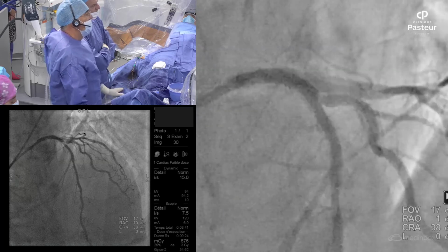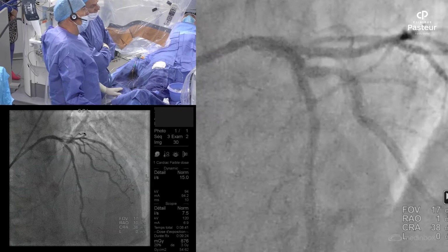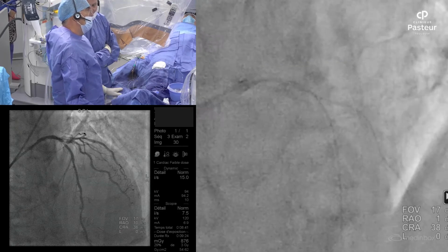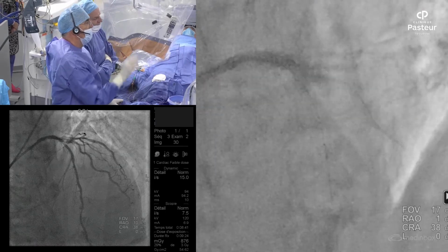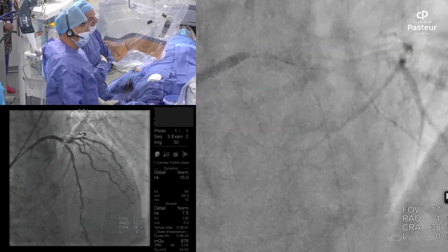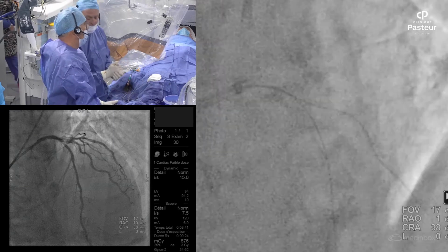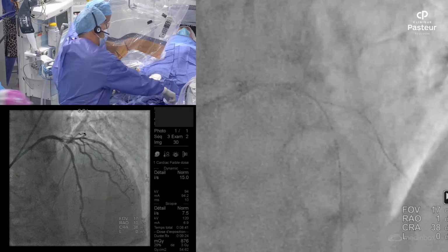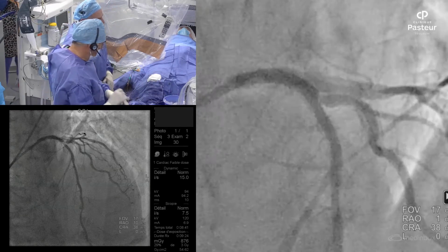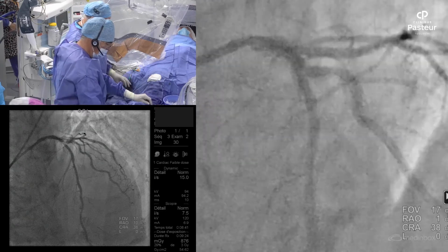So, next step now is to stent the LAD. We're pretty late. Maybe an 18 should be the length, should be okay, because we have to think about the 10 millimeter before the bifurcation in order to perform the POT. The diameter, 3.0, and then we will take a 3.5 to do the POT. Okay? So 3.0 by 18 millimeter stent. I'll explain, Bruno.